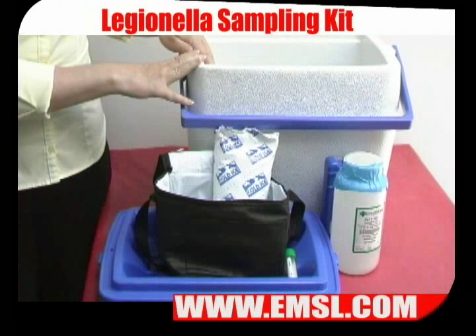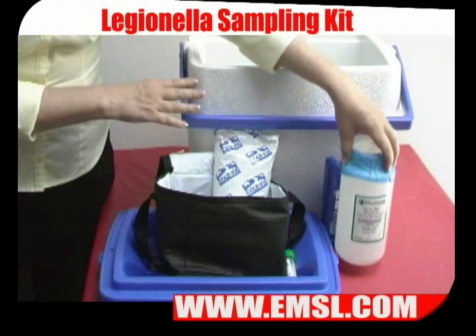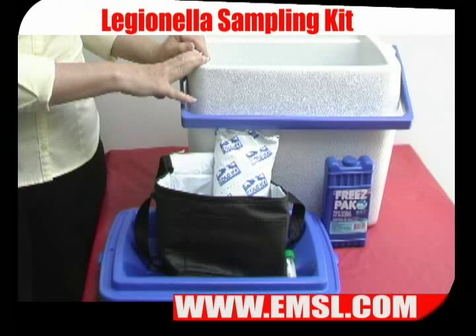When you are ready to ship your samples, use an appropriately sized cooler with freezer packs. Make sure that you do not use wet ice, since it may melt and contaminate your samples. Dry ice also cannot be used because it is considered a hazardous material.